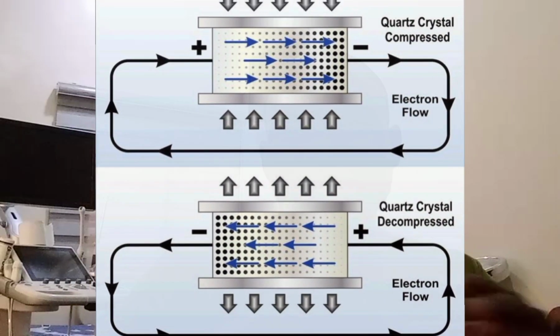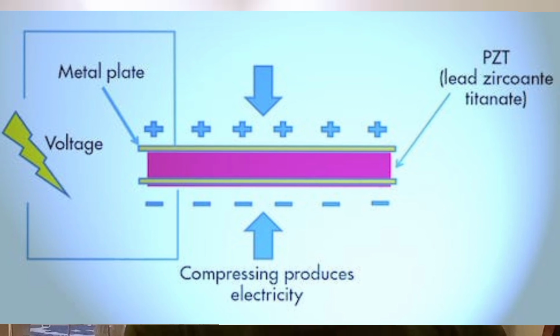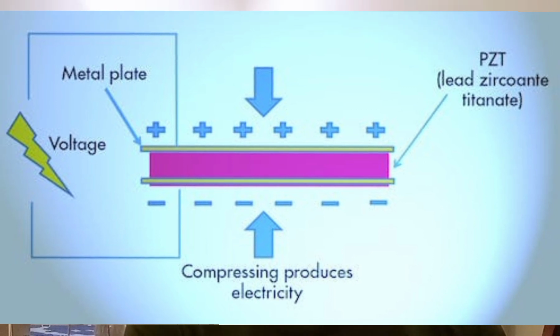A high voltage current is applied to either end of the crystal by the electrode, which causes it to expand. The polarity of the applied voltage is then reversed, and the crystal becomes smaller in size. The electrodes have positive and negative terminals, which give and collect electricity. When an electric field is applied to the crystal, it causes the dipoles to realign, which causes a change in the dimension of the crystal. The crystal thickness increases when the voltage is applied.